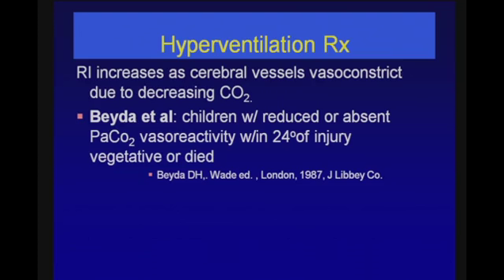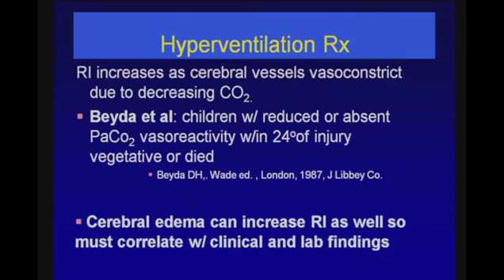So RI increases as the vessels vasoconstrict due to decreasing CO2. This suggests reactivity. If there is reduced or absent CO2 reactivity within 24 hours of an injury, this has a very poor outcome. Again, cerebral edema can increase resistive indices, so you have to correlate with clinical and lab findings.